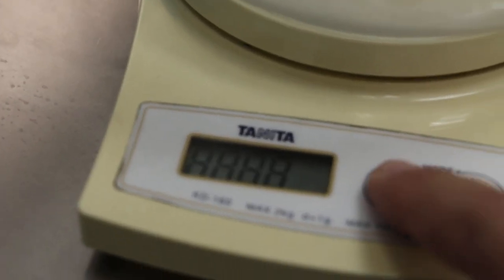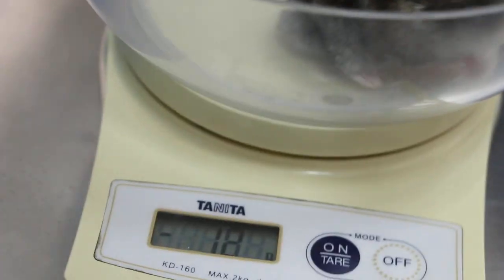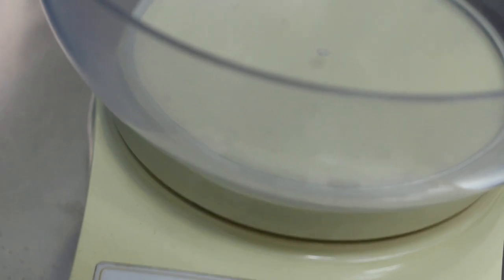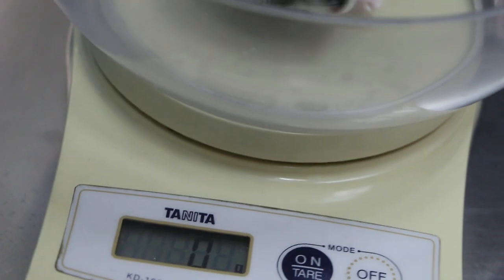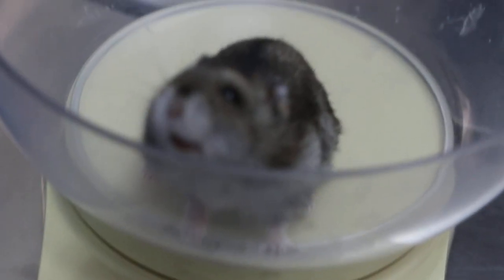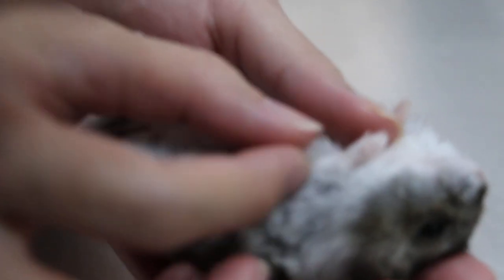Is it male or female? Let me put the zero on the scale first. Okay, 54 grams. A bit overweight but not so bad.